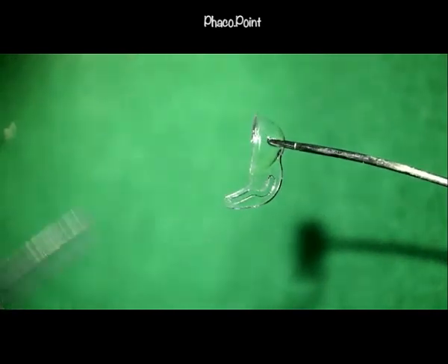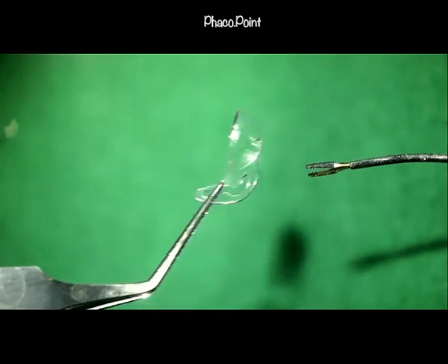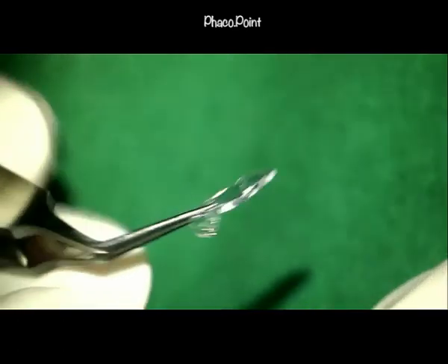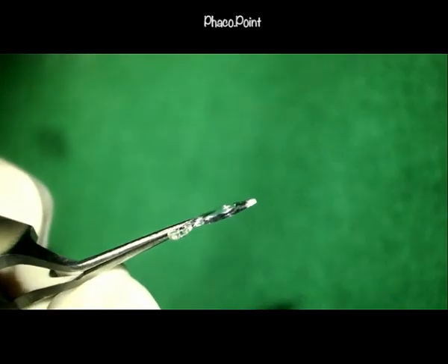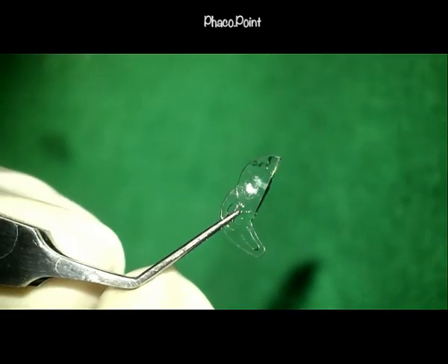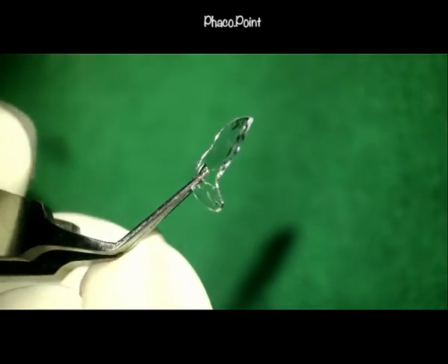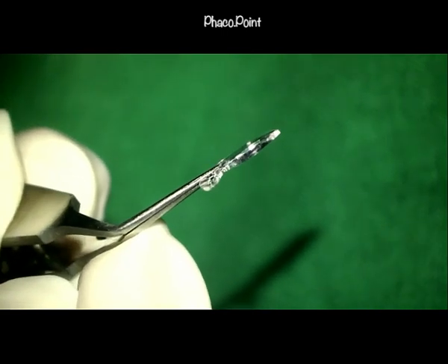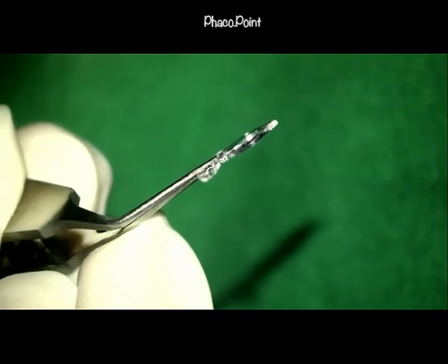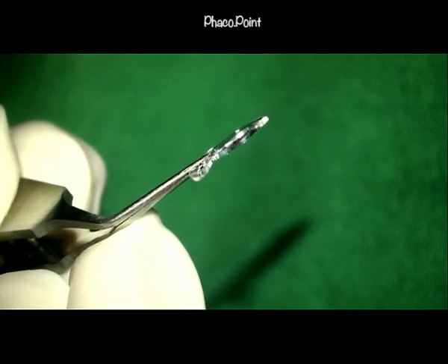When the haptic is held with McPherson's forceps and pulled out of the incision, there is no resistance to its removal. Note the actual thickness of the IOL down its center — the lenses are quite thick in the middle, thereby necessitating a significant opening of the scissor blades to cut it effectively. We must take care when cutting the central part of the lens to avoid any damage to the corneal endothelium.